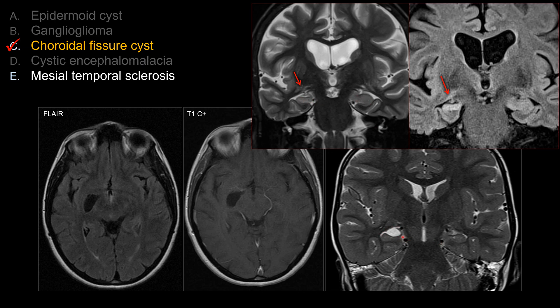Let's look at our case. Even though at first glance you may mistake this for a dilated temporal horn, you should appreciate that the hippocampus, while it's being compressed, does not have an asymmetric signal compared to the other side. Also, the hippocampus still remains normal in volume — there's no atrophy — and there is preserved internal architecture. So this is not mesiotemporal sclerosis.